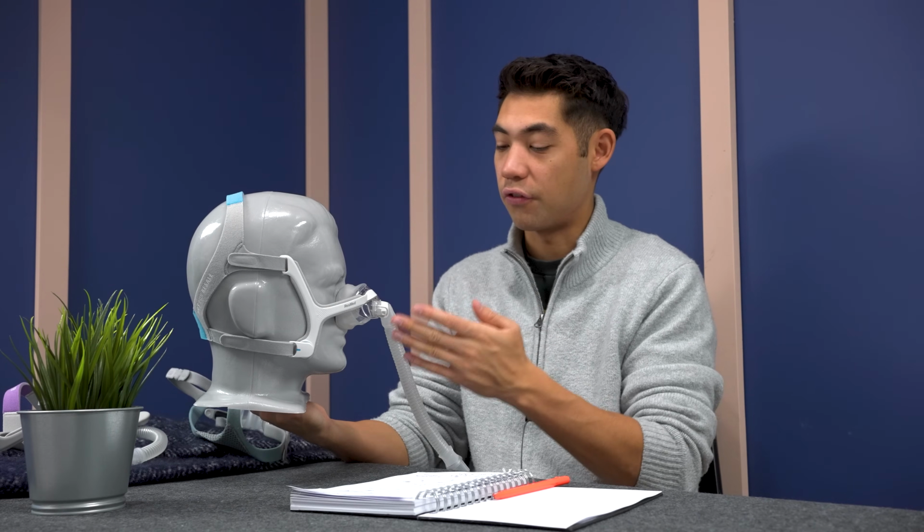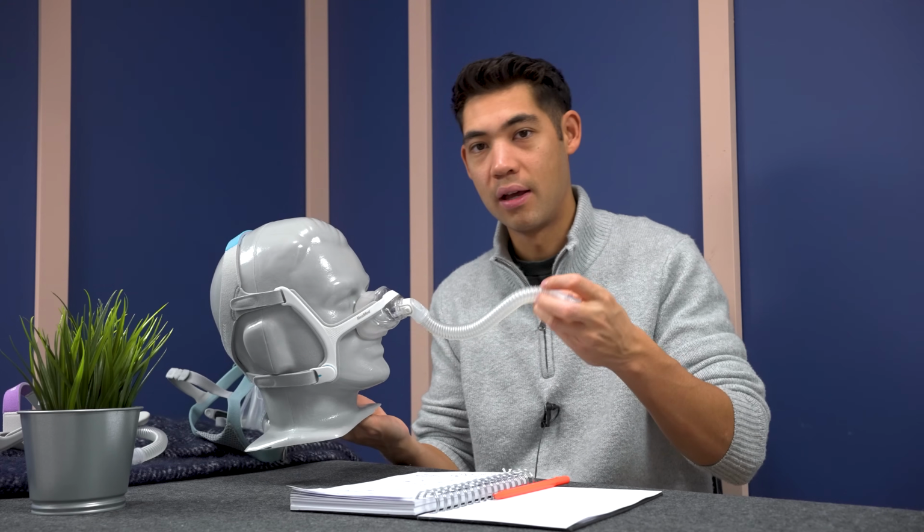And as you can see, it's a front mounted mask. However, they do have this little extender portion here, which is a lot lighter than your climate line tubing. So it does help with the weight feel. Again, I still recommend having a tube hook. But yeah, it's a front mounted mask, so you're not gonna have the benefits of a top mounted.